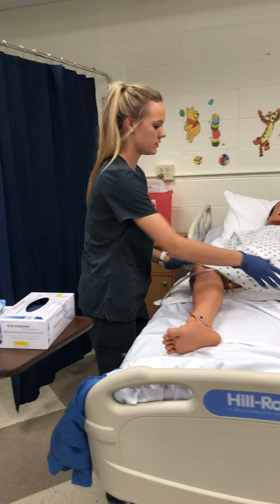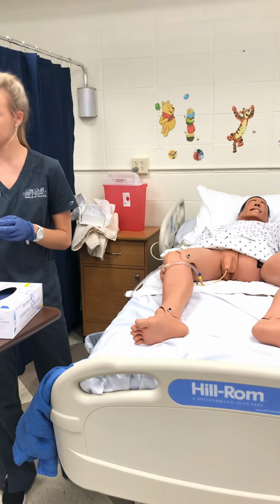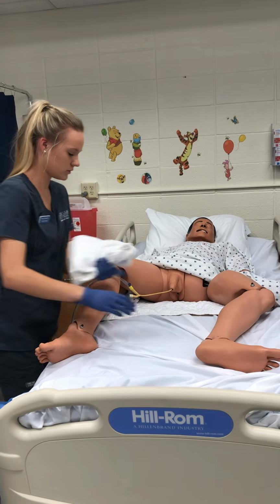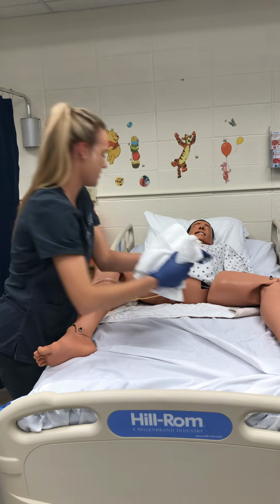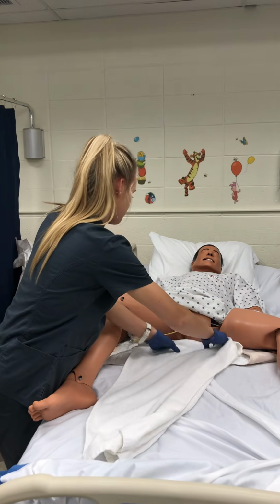Mr. Jones, I'm going to expose you. And I brought a towel to put under him for any leakage or drips or anything that come out with the catheter. So I'm just going to put this underneath him here.